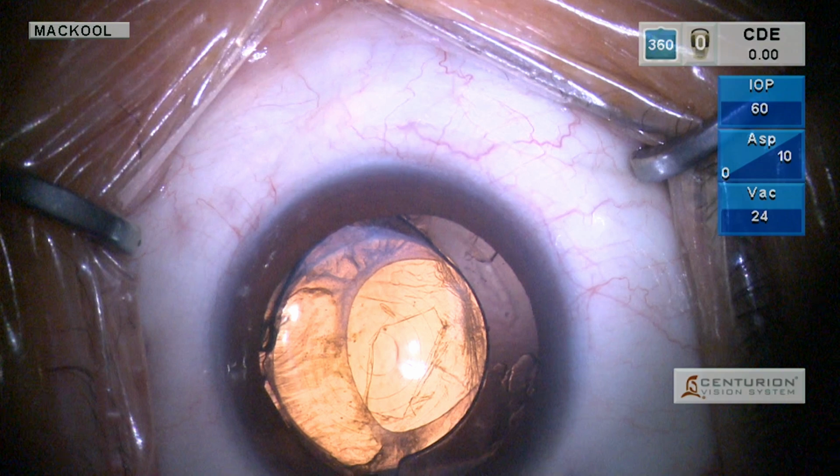center it. Now, our task is made possibly more difficult by the existence of a small but open central YAG laser posterior capsulotomy. And the patient has 3 diopters of astigmatism because of the lens tilt. It's not keratometric, and also has poor near vision, and that's likely related to the fact that the central diffractive rings that provide near vision, only one of them is fully visible.